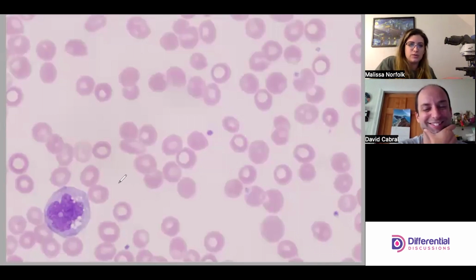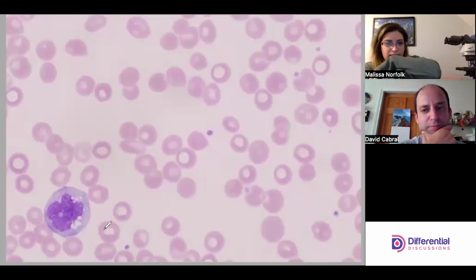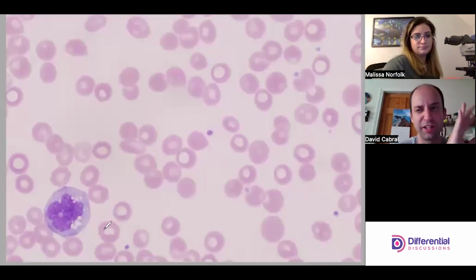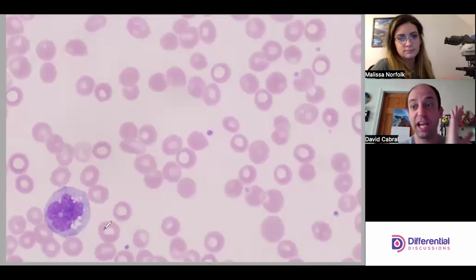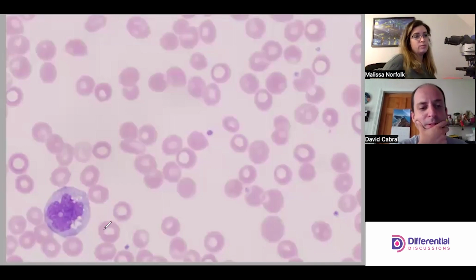So what we're looking at is wondering if this is a whole ring, all connected, or if this is literally a hole punch in the center of it. But it looks like there's some folds in this area, maybe even right over there, some over here. So it looks like it's just pieces folded on top of each other. And that, correct me if I'm wrong, would be kind of a dysplastic finding if we were to have seen it here, which it is not. Correct. Yeah, that would be dysplasia, but this is just folds.